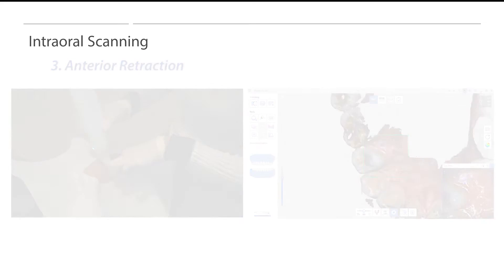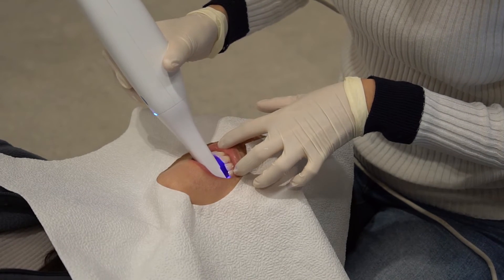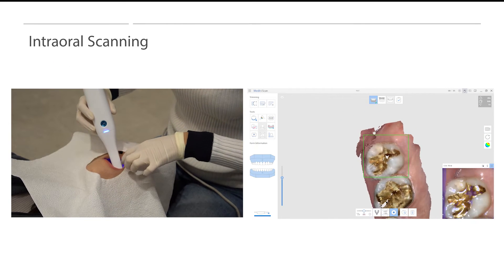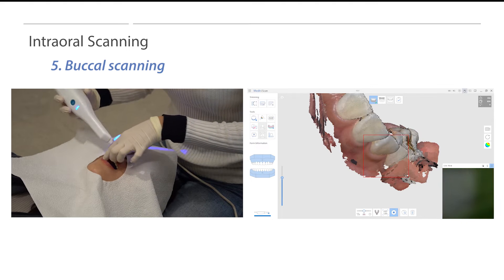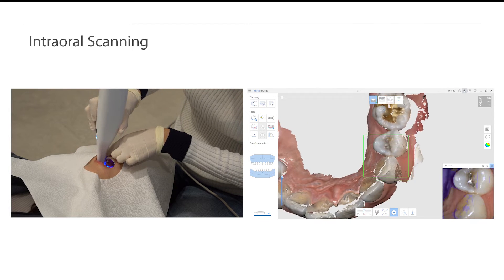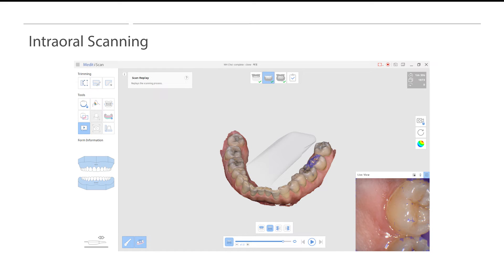After scanning the occlusal surface area, users must tilt the scanner tip 45 degrees to scan the buccal or lingual side. By tilting the scanner at 45 degrees, users can capture more of the occlusal surface areas along with the gingiva around the buccal or lingual surface. This will help the scanner properly stitch the data between the occlusal surface, buccal or lingual, and the gingiva. When scanning the buccal or lingual side, we recommend having the occlusal surface, buccal or lingual surface, and the gingiva at a 1 to 1 to 1 ratio. Users can monitor the range through the live view window on the bottom right-hand side.